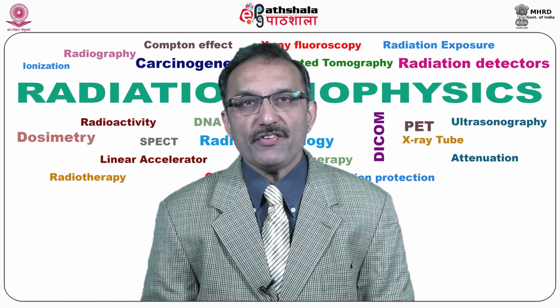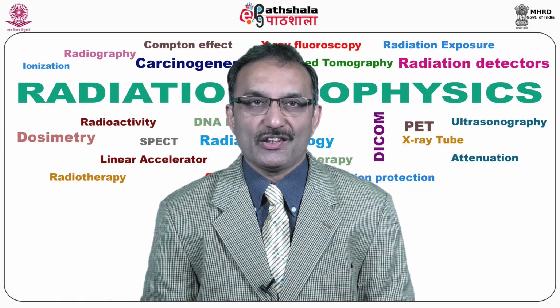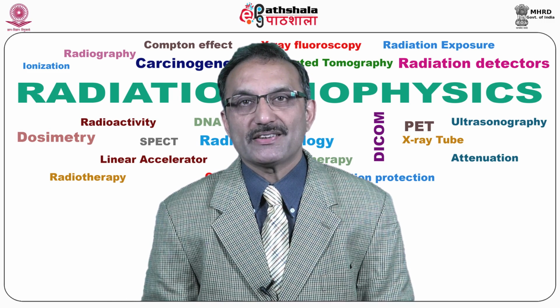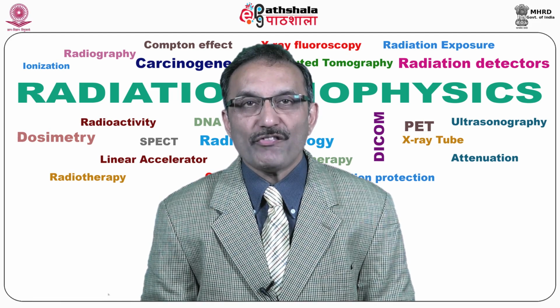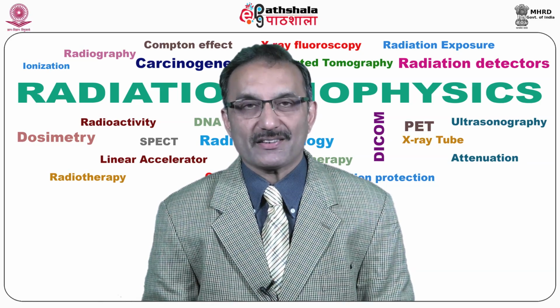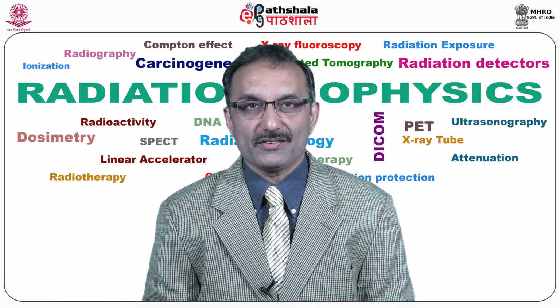The main difference between nuclear imaging and other radiological tests is that nuclear imaging assesses how an organ functions, whereas other imaging methods assess anatomy. It means when we talk about X-rays or CT or MRI, what do we get? We get the anatomical structure of the human body.